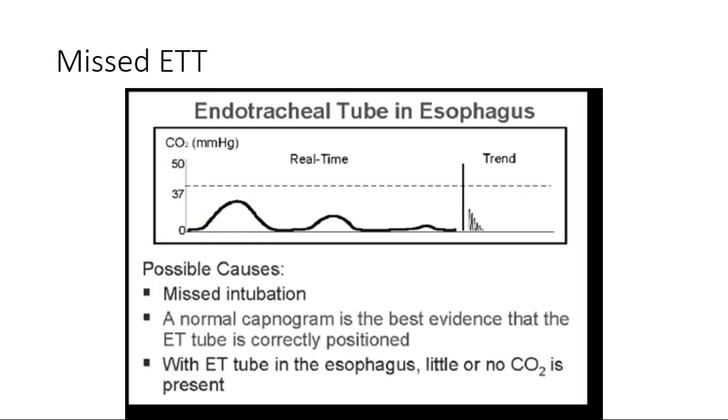In this context, this is basically a missed intubation. This is a patient who you intubated. They had some CO2 in there somewhere, and it went down quickly, maybe in their GI tract. And as I said, you can't look at just one ventilation. You've got to look for at least 5 or 6. You don't have a great waveform. You have crappy numbers, and they drop quickly. This is a gut tube.